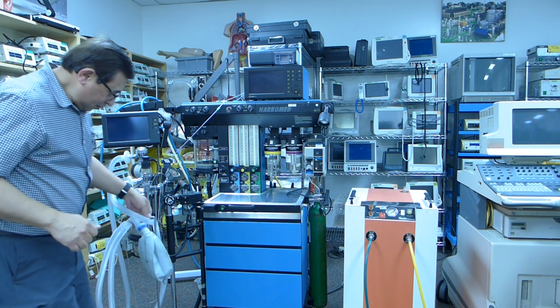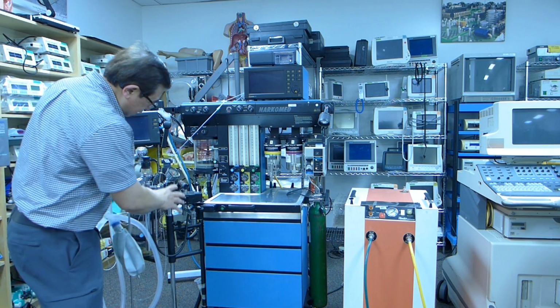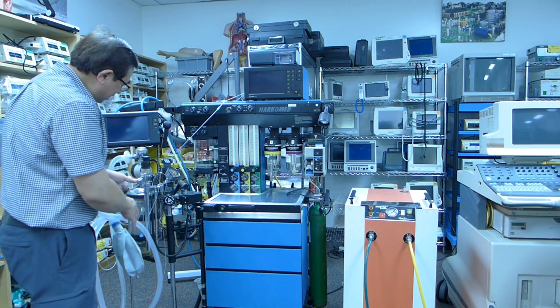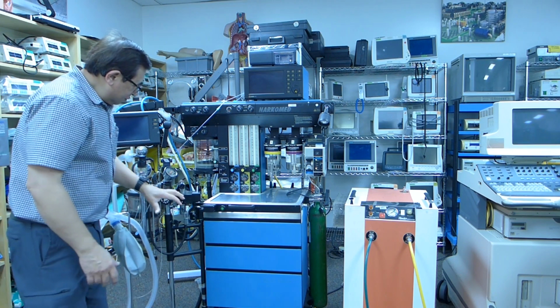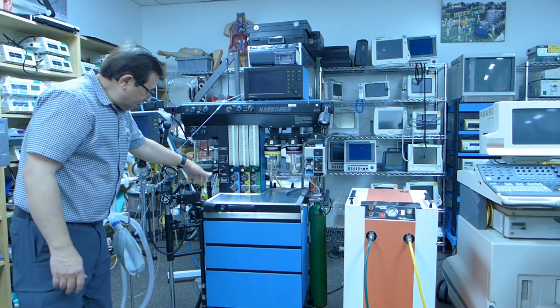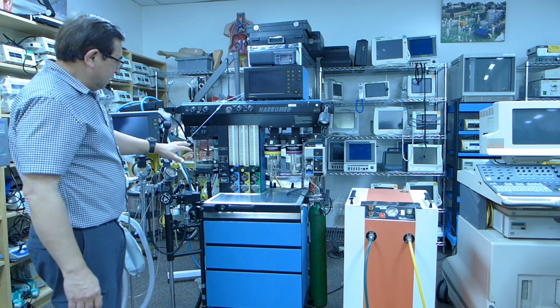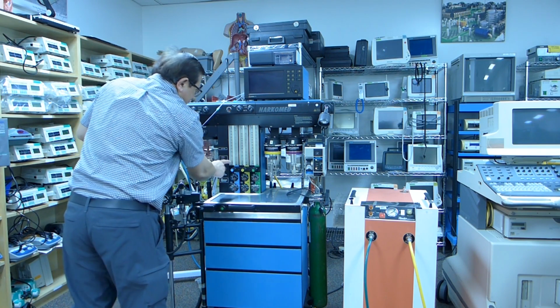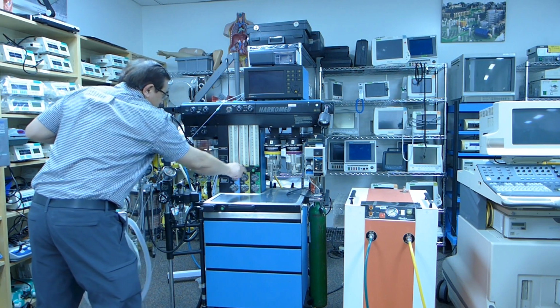From this is a rebreathing circuit system that we already talked about. This has automatic or bag mode. Overall, the machine's 3-gas system has nitrous oxide, air, and oxygen.